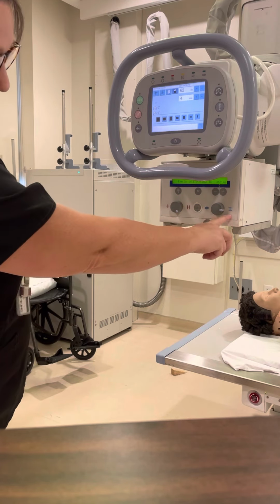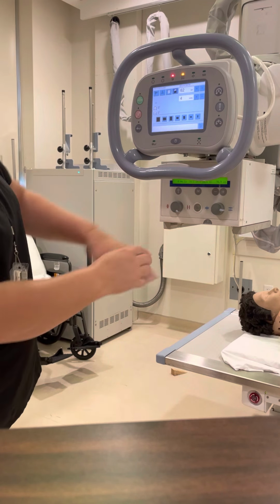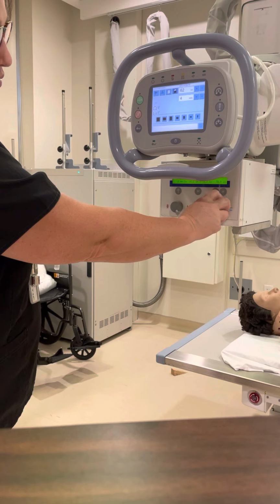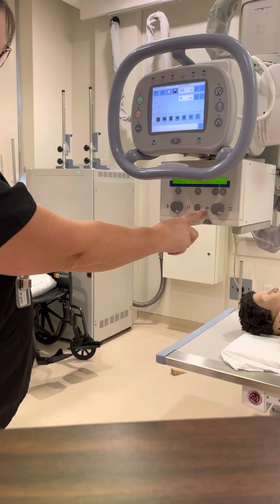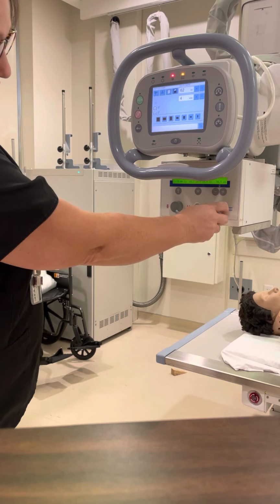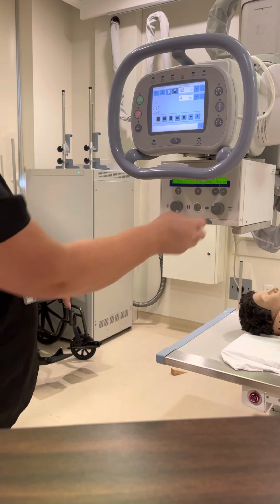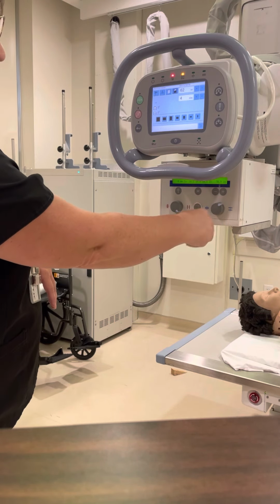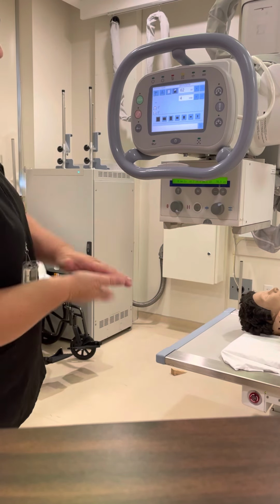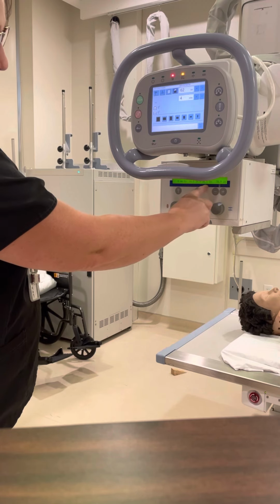On our patient, if we want to open the width, so that affects the length. This is length and this is width. So if we want to affect the width, you can see these are close together and these are far apart. So if I turn it to the left, then it's going to be a more narrow cassette. And if I turn it to the right, then it's a wider cassette. So length is always on the left side and width is on the right.